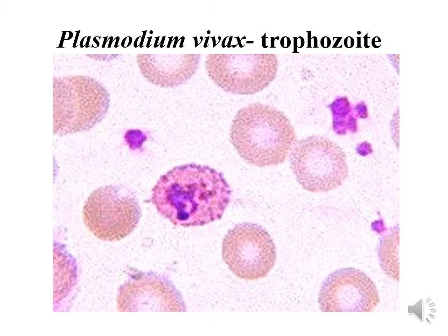Of course, you could find milder dots in the case of infection with ovale, but in ovale the cell is usually somewhat oval and irregular at the poles. Also, you can find a few dots in red blood cells infected with Plasmodium falciparum, and those dots are known as Maurer's dots.